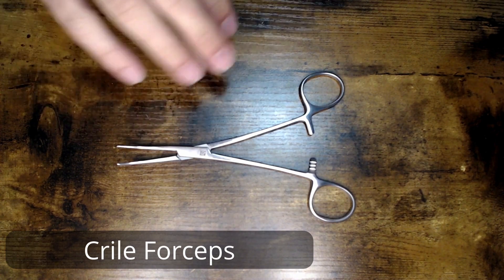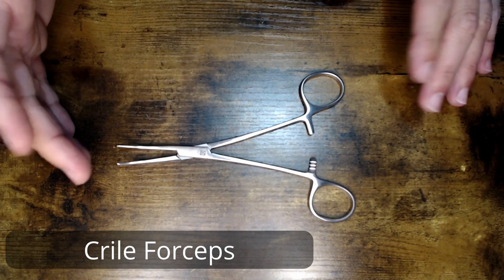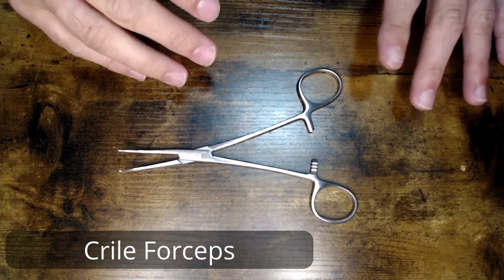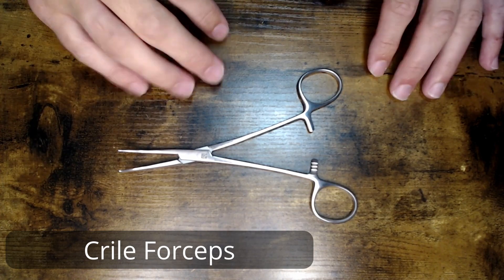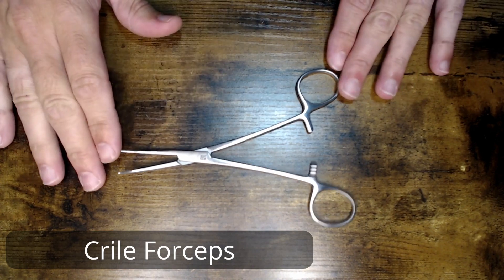This is one of the more common instruments that you're going to see in your stringer trays. Alongside of your mosquitoes and your Kellys, Kryals are all over the place. This is very, very common — one of the first instruments that you'll probably learn in your training.